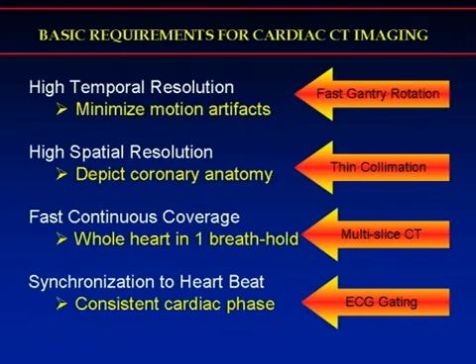So what we want to do is try and find an easy way to evaluate the coronary arteries non-invasively. And fortunately, with the advances in scanner technology, we can now image the coronary arteries very well with cardiac CT. So what are the basic requirements of cardiac CT imaging?